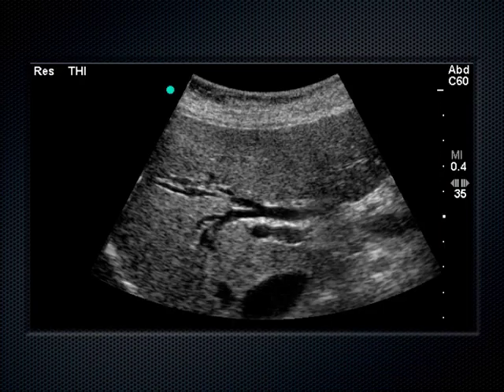Then one more time walking through these structures. What's this down here? IVC, seen in this case in the short axis. Anybody want to take a guess what this is, this hyperechoic thing over here? Runs along the edge of the liver. It's a very thick, curved organ, hyperechoic diaphragm, exactly. Just a little piece of the diaphragm right there.